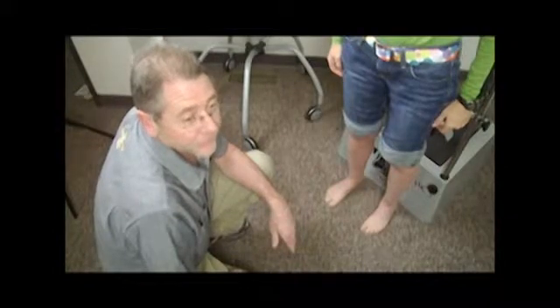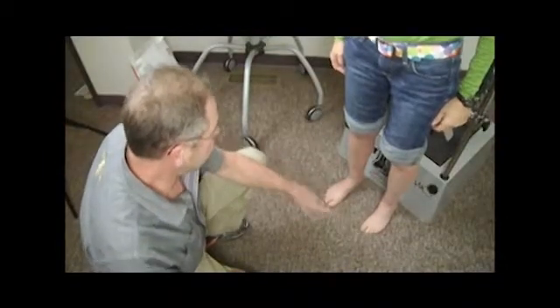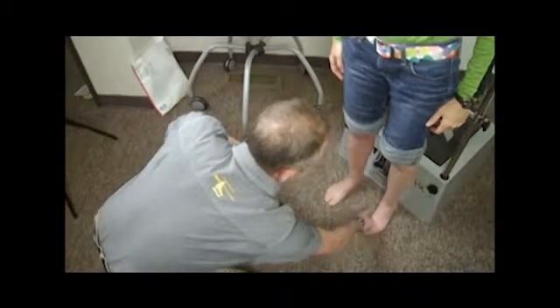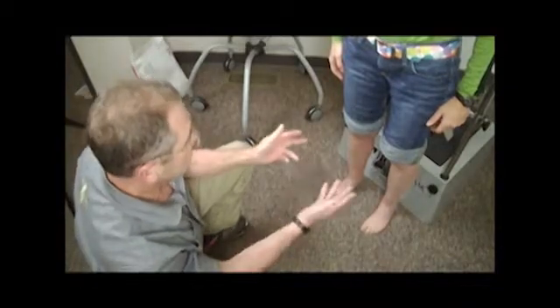We're going to do a quick evaluation. This is more of a refresher for you, but this is the way I do it in my clinic. I'm going to start with the frontal view and look at the feet. Look for any anomalies like toe contractures, maybe hallux valgus or bunion, Taylor's bunion, any accessory navicular, pump bumps, that sort of thing. This is an opportunity also to check the alignment of the knees, if there's varus or valgus. I don't see anything remarkable here, so go ahead and turn around for me.